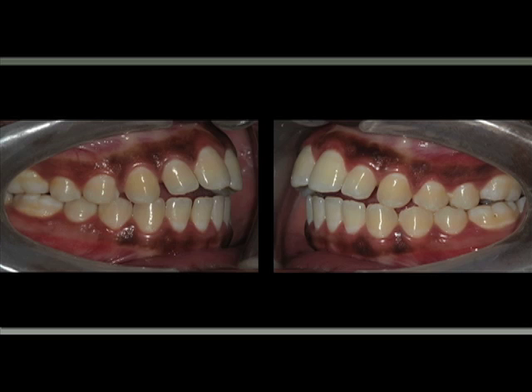So I will show you a couple of cases like this one here, where we need to coordinate the arches. It is a unilateral crossbite in an adult that couldn't be corrected surgically, so we camouflage, we coordinate the arches to basically camouflage the transverse dimension and be able to have the upper arch overlap the lower arch. And you can see an open bite, so on this view you can see that the occlusal planes, upper and lower, are not parallel, they are divergent.